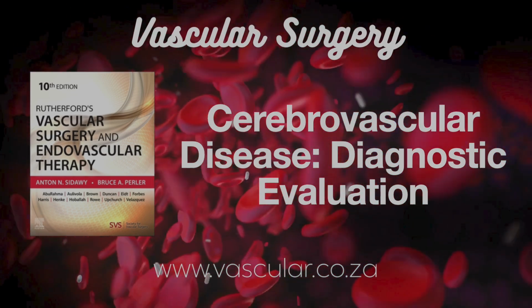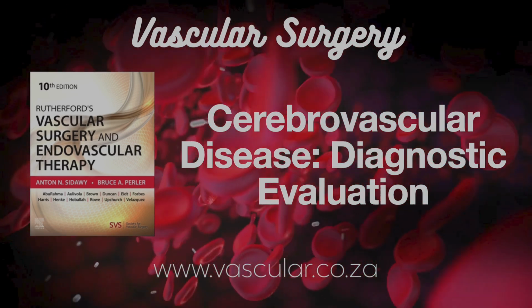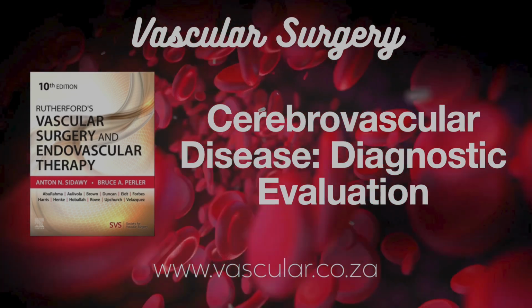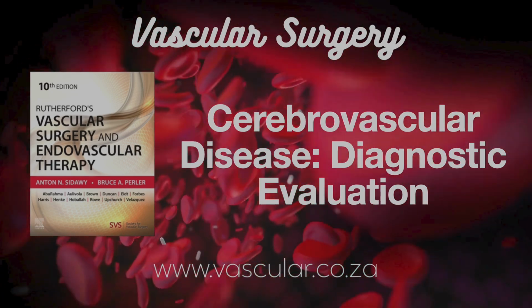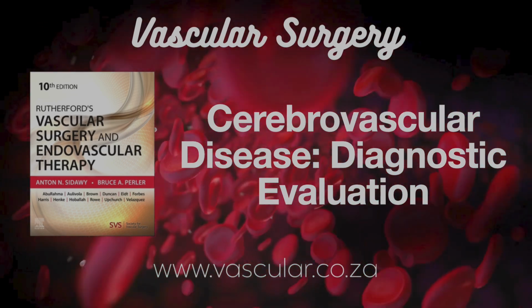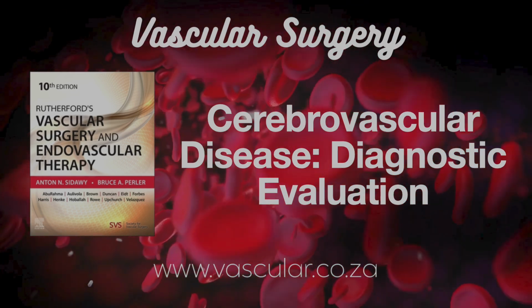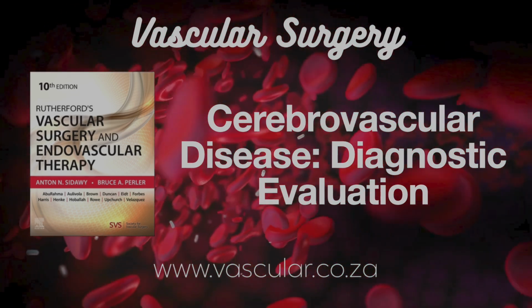So how does TCD fit into evaluating carotid disease in the neck? Is it used routinely? Its routine role specifically for neck disease is fairly limited, mainly because most vascular labs just don't have TCD capability as standard equipment alongside their regular duplex machines. Availability again. Yeah, but where it can be really useful is in diagnosing that spontaneous embolization. If we detect these embolic signals, often in the middle cerebral artery on the same side as a known carotid stenosis, What does that tell you?